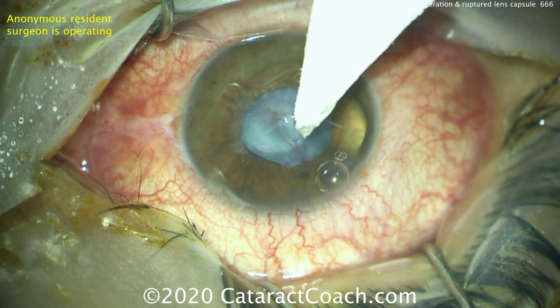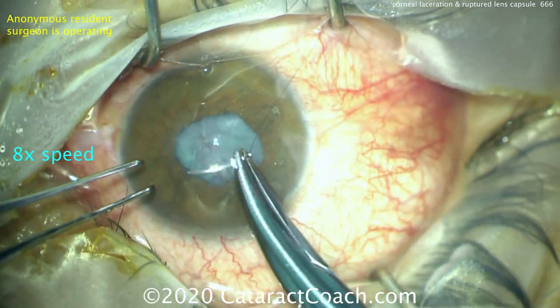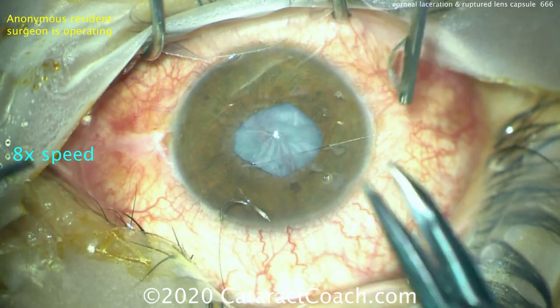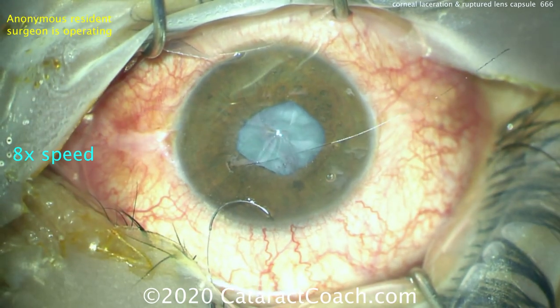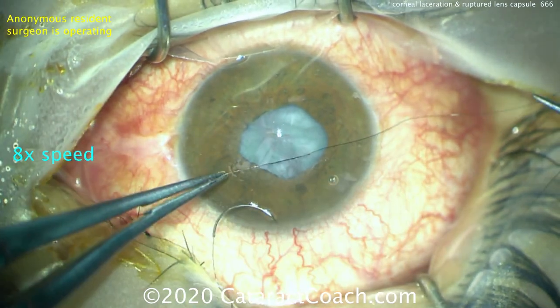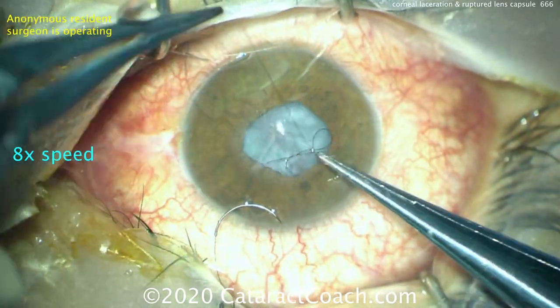Step one is to close this laceration. Find the apex of the laceration, or find the center of it, and pass a suture. We want at least a millimeter on either side of the laceration, and this suture should be about 80–90% depth. Avoid multiple passes of the suture, as it will just macerate and tear up the tissue. Remember, the central cornea is only 500 microns — very thin.